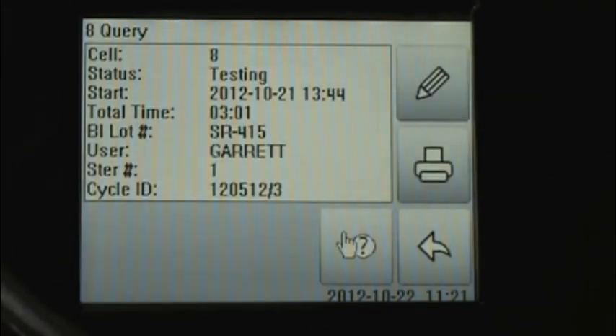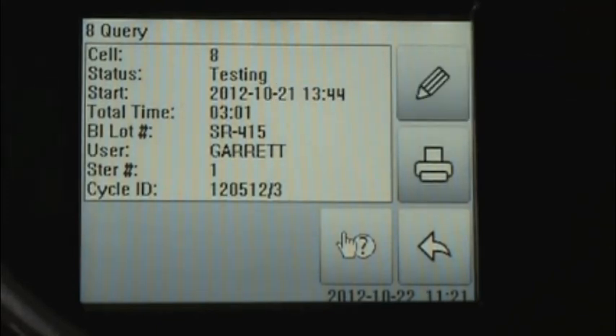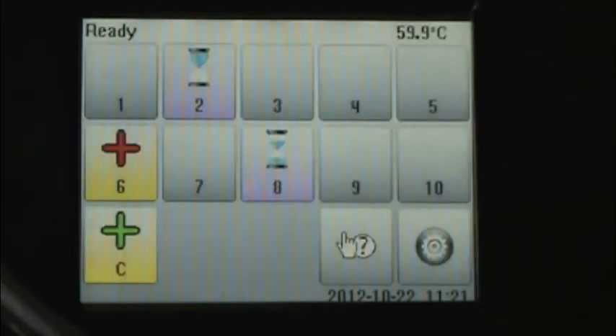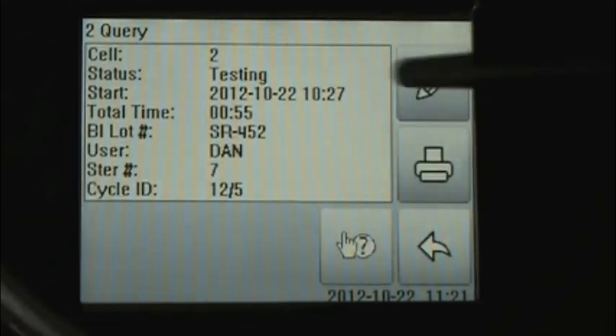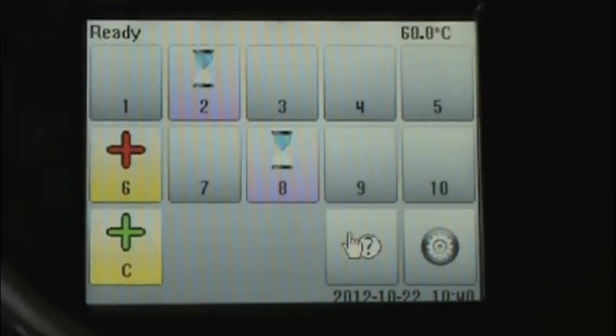Touch cell eight to see the query screen, and we see that this biological indicator has spent three hours, one minute in the incubator, compared to cell two which has spent only 55 minutes thus far. The gear symbol in the bottom right-hand corner indicates incubator settings.